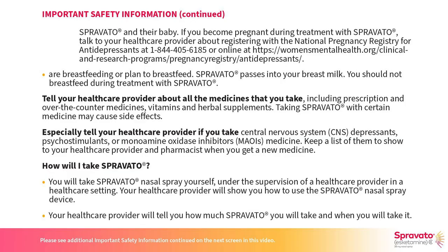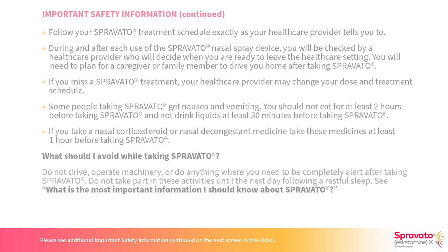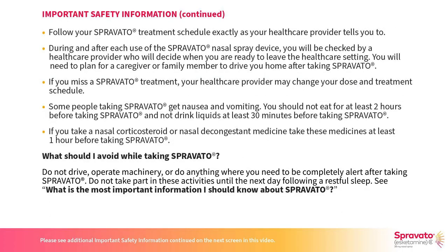How will I take Spravato? You will take Spravato nasal spray yourself under the supervision of a healthcare provider in a healthcare setting. Your healthcare provider will show you how to use the Spravato nasal spray device. Your healthcare provider will tell you how much Spravato you will take and when you will take it. Follow your Spravato treatment schedule exactly as your healthcare provider tells you to.